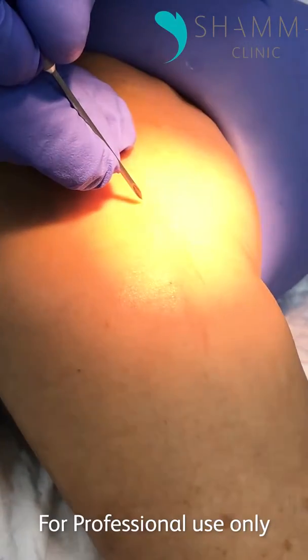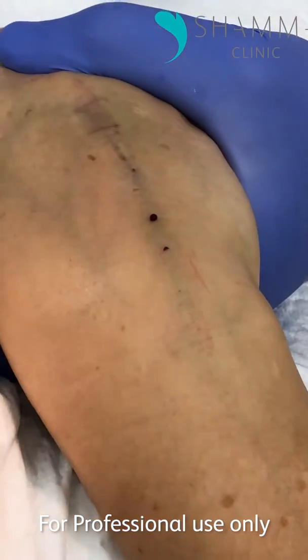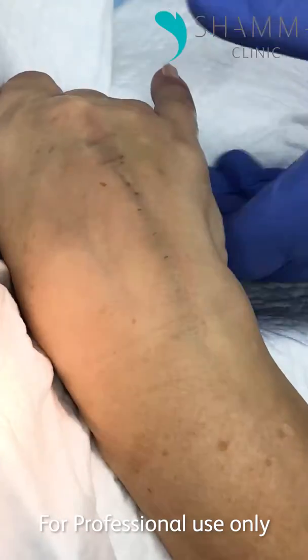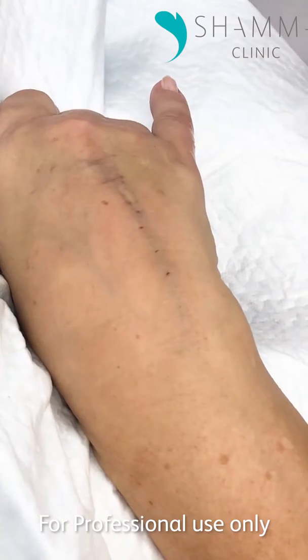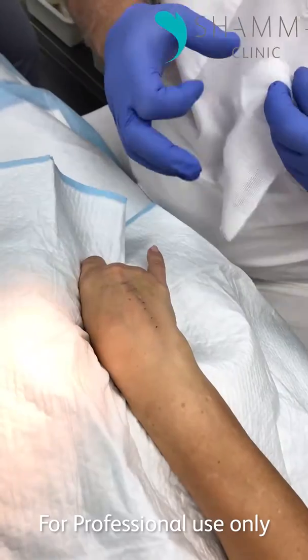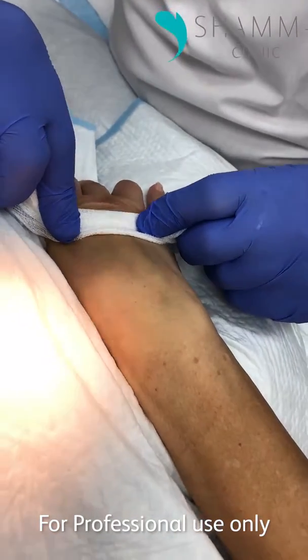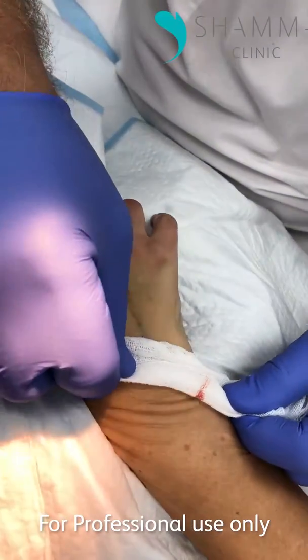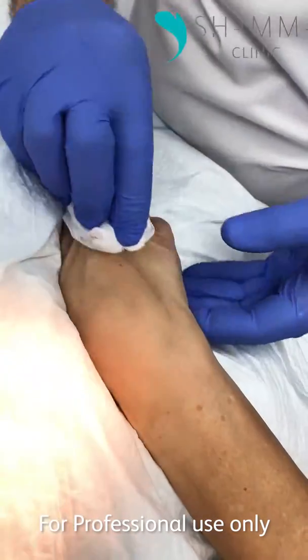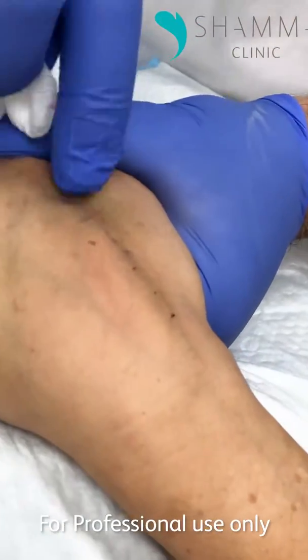Ludmilla, you're going to feel a small stab. So after we do this, we milk it. I have a special way of milking it — we use a 4x4 gauze. This is really mainly for colleagues in vascular surgery and for patients, but we'll put it on YouTube so that everybody will benefit from it. You can already see there is an improvement, and you can imagine how it will look in a day or two.